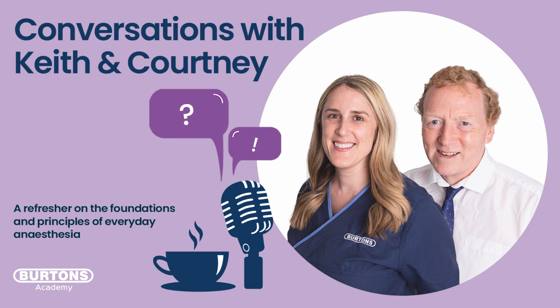So IE ratio is important. The value of 1 to 2 means it's got twice as long to recover as it did to suffer the excess pressure. So keep it beyond 1 to 2. That's the one thing I was going to mention. Perfect. I think that's a great summary.